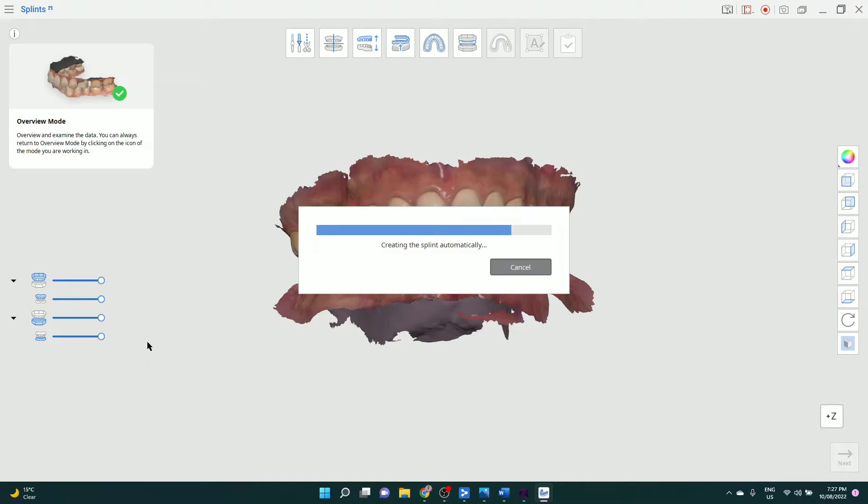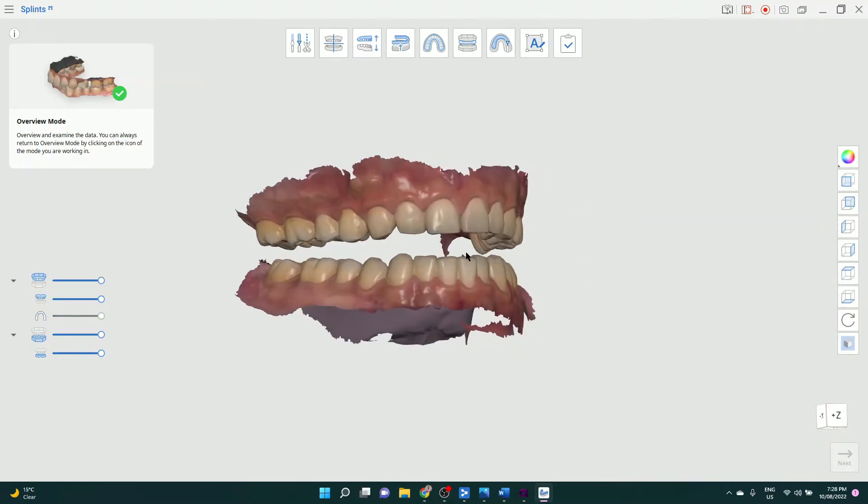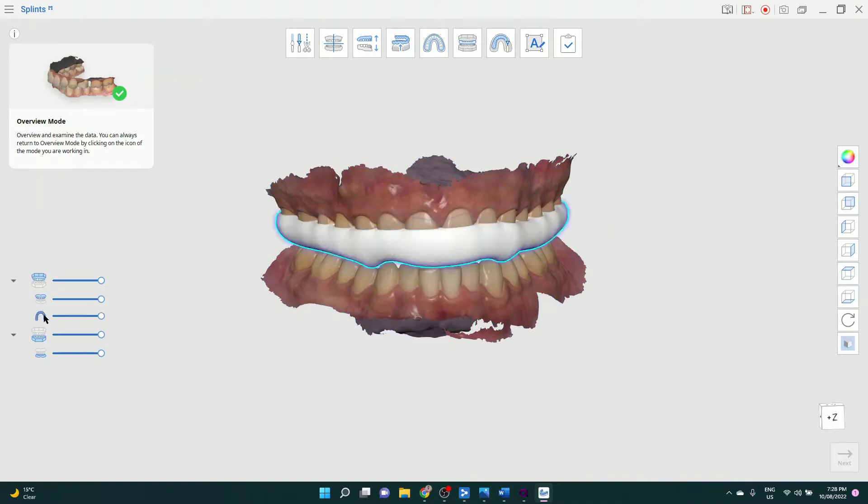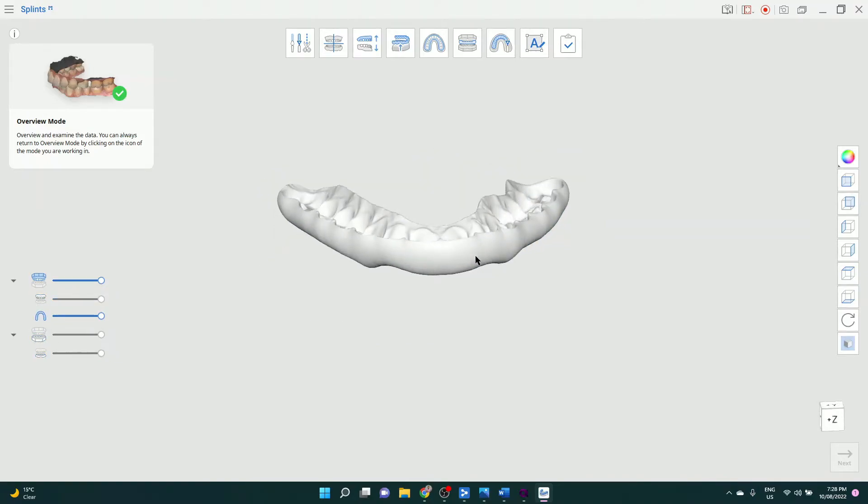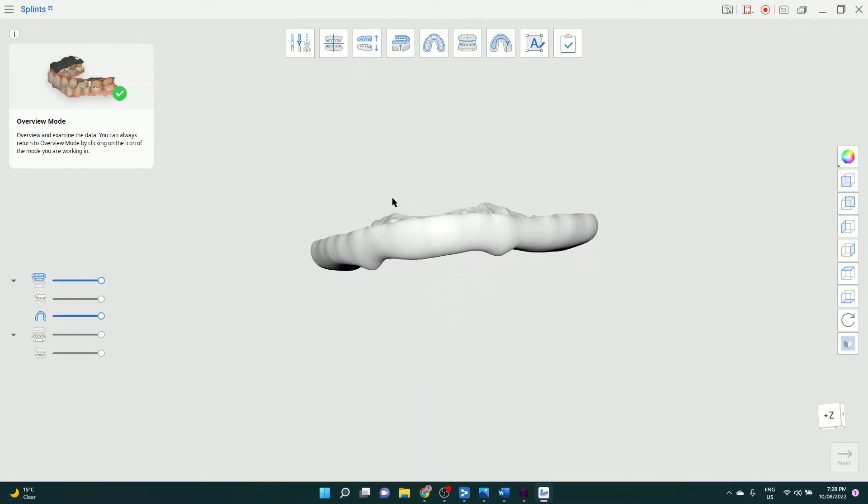Yeah look, no one likes to wait for software to think, but if the software is doing your work for you, then great. So that's the bite registration, and this is the actual splint that's been made by the software.